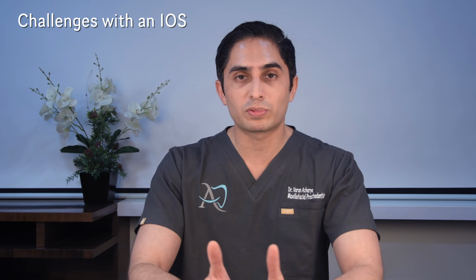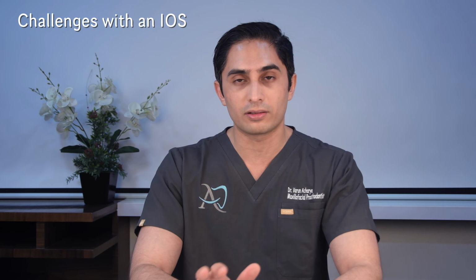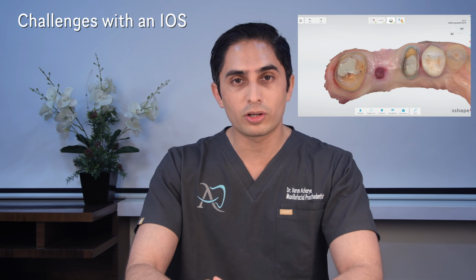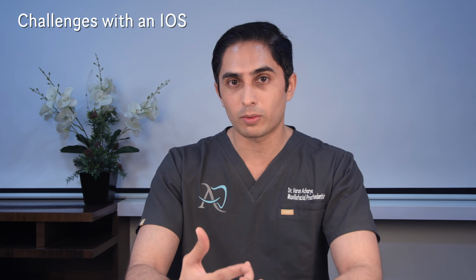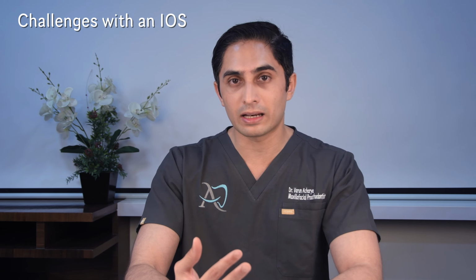If your preps are equigingival or supragingival, scanner, no-brainer, right? Very, very easy to do. We've had great success using intraoral scanners for 3-unit bridges, for 4-unit bridges. We've had it for crowns, not a problem. For veneers, not a problem. But we have had problems when we are attempting inlays and onlays.